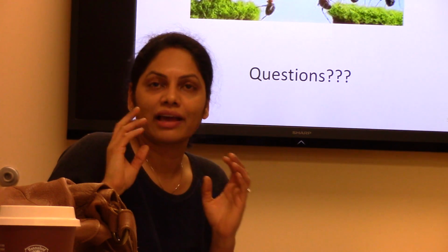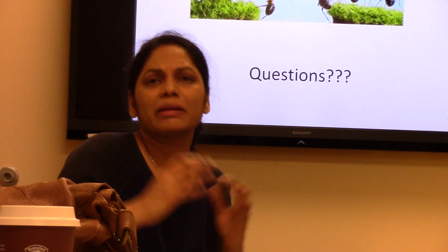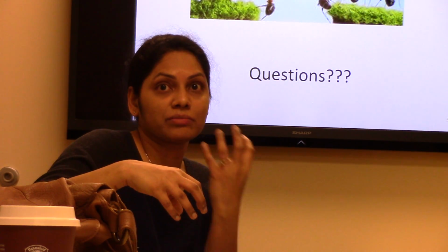Before, we would see maybe you guys deploying 2 valves. Will we not see that as much? Yeah, you may not see that. Now it's decreasing, that is the reason. And sometimes we actually go into the case thinking that we would deploy 2 valves in this patient. Because if we are doing this for more AI and bigger root, we have to put 2 valves. So if they have no calcium, 1 valve goes in for anchoring purpose, and the other one goes in. Okay, gotcha.